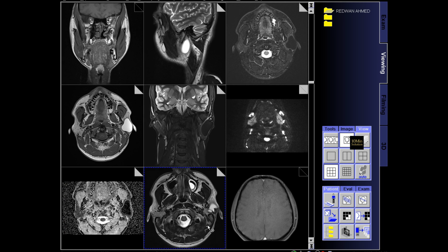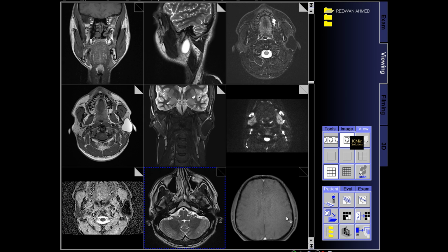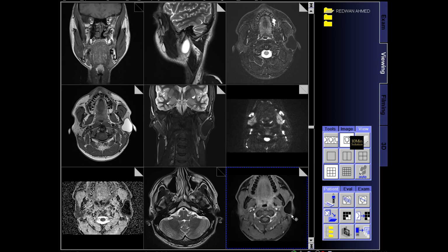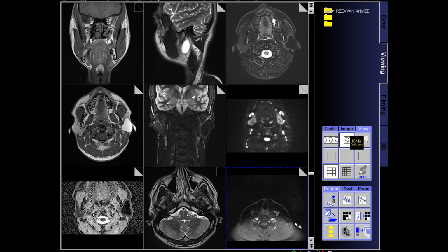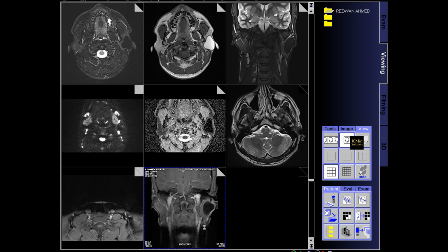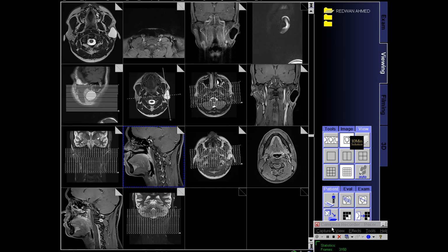Essential MRI sequences. A high-quality parotid MRI includes a combination of beautifully complementary sequences: T1-weighted images, T2 with fat suppression, STIR or SPAIR, T1 fat-saturated post-contrast, and diffusion-weighted imaging. Together, these sequences create a complete and accurate diagnostic picture.